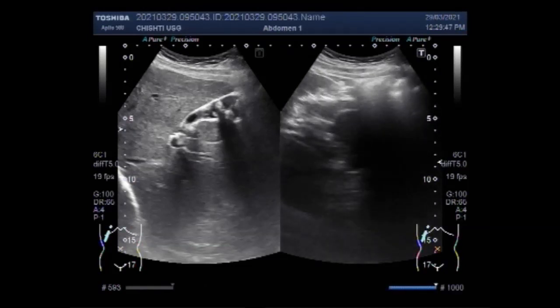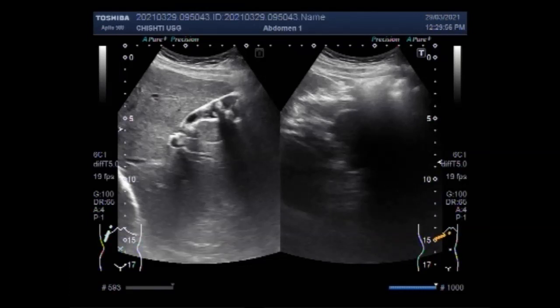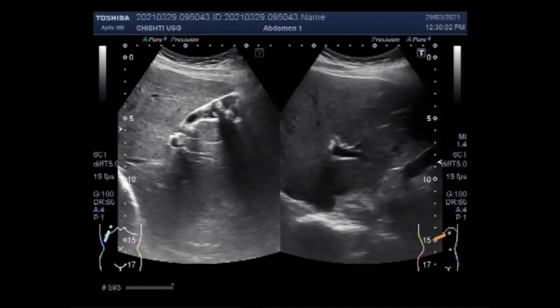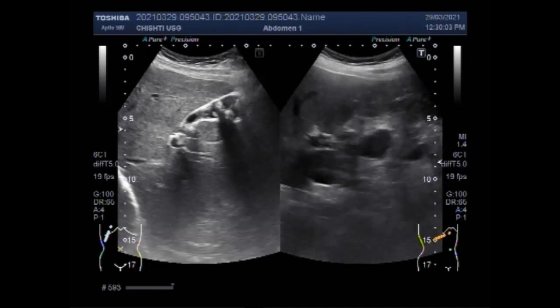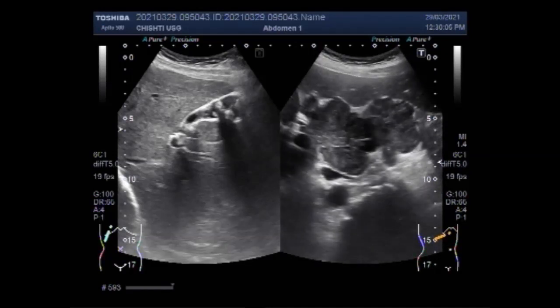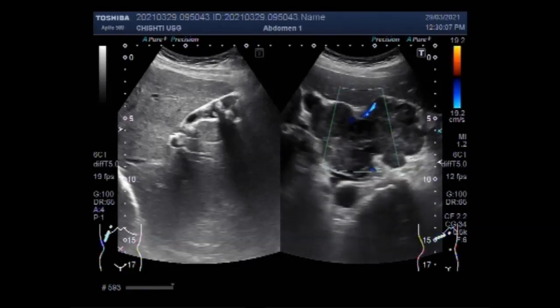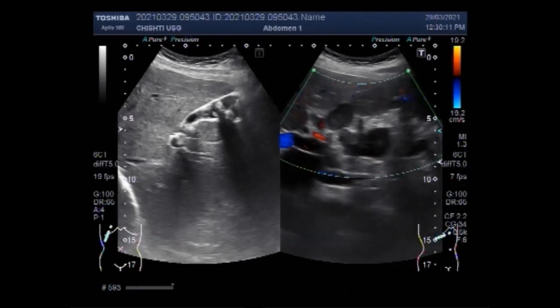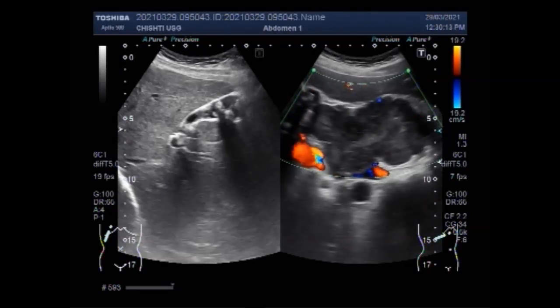Now the patient is turned side-on and you can see the liver hepatic parenchyma. You can now clearly see the large mass in the porta hepatis. The mass is rectangular in shape and is semi-solid to solid in consistency. Significant blood flow is seen.